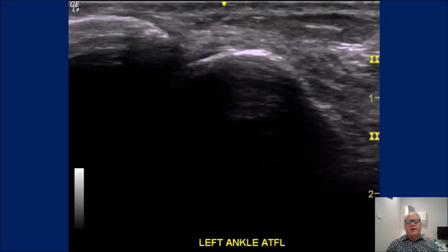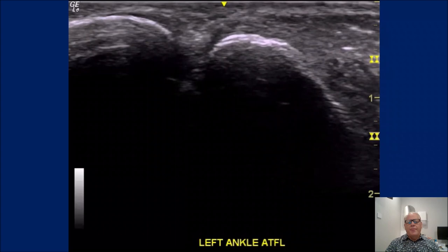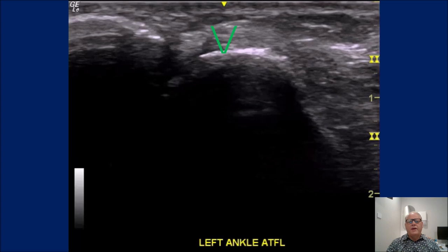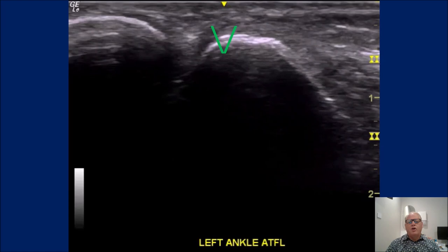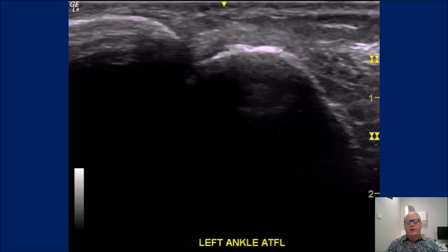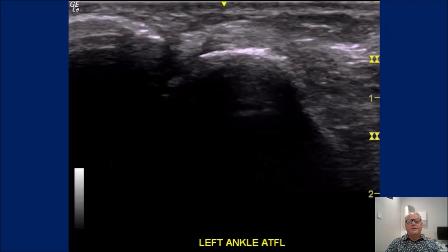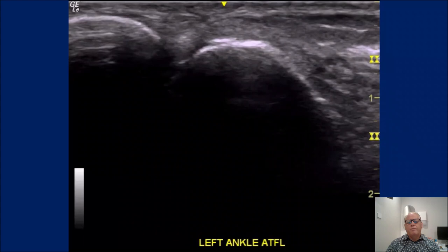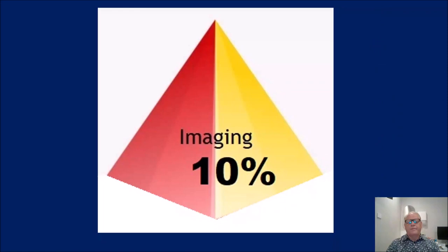This is what the anterior drawer looks like with it completely ruptured — you can't see any fibers at all, the bones are completely moving independently. The little green arrow shows fibers moving in the opposite direction at the fibula end. This is a complete rupture with no discernible fibers of the ATFL, and the talus is moving quite substantially in relation to the fibula.